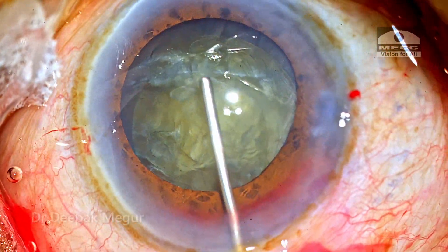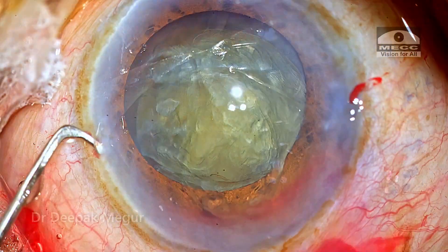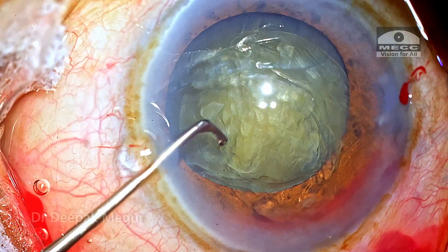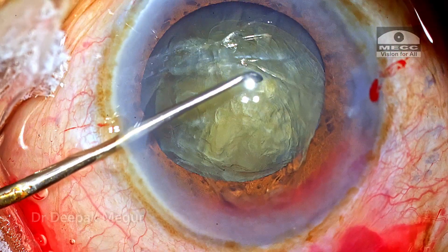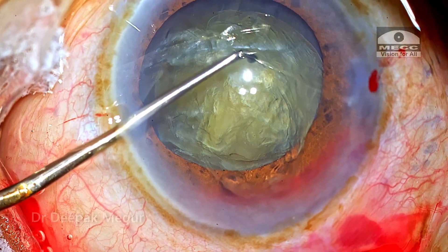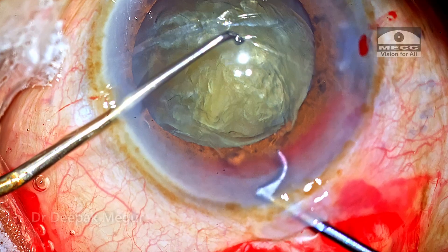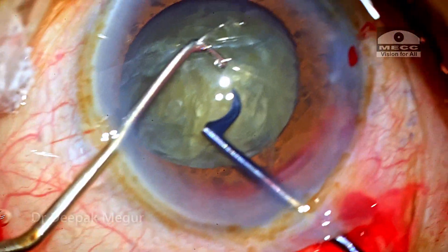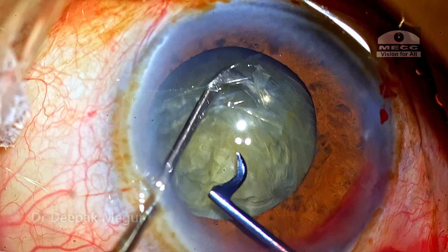Cohesive OVD is placed in the anterior chamber. My plan is to perform in-the-bag nucleus bisection. So the two familiar instruments are picked: the horizontal blunt chopper or the Chang chopper in my left hand, and the Dr. Sohail Khan pre-chopper in my right.